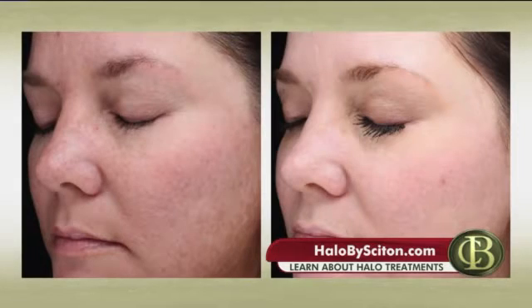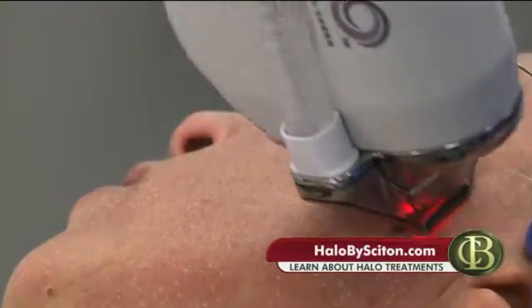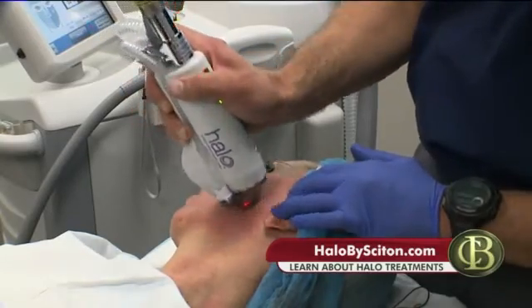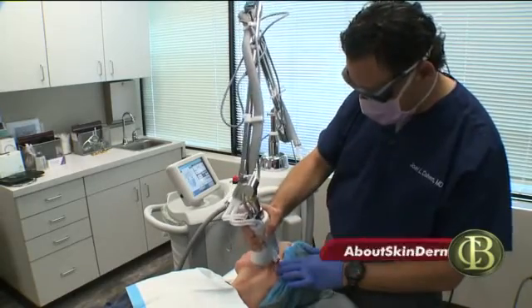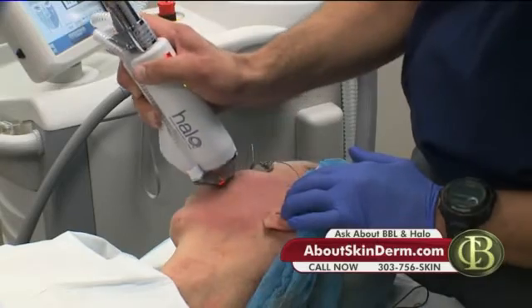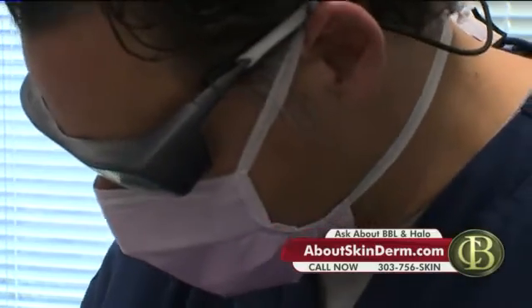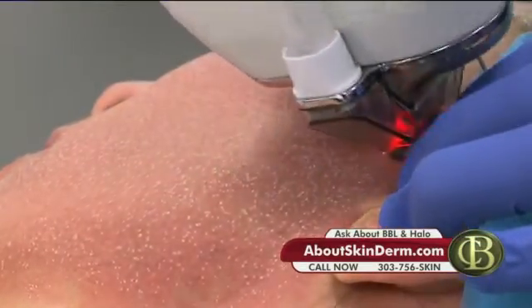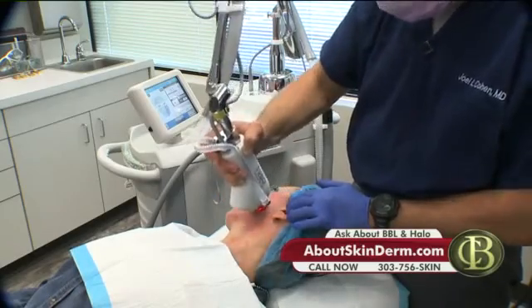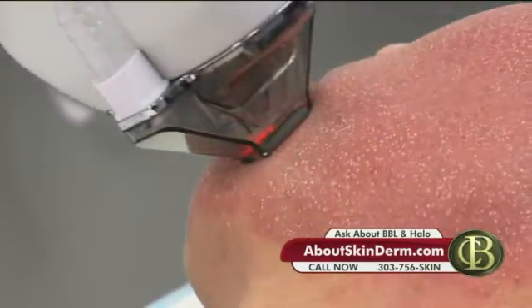This laser is more or less the double whammy of the laser world. It's a blend of 2 wavelengths. One goes deep, the other focuses on the surface of the skin, and they work together at the same time in one treatment. You were mentioning that with the downtime, it depends on how much downtime people have. You can cater it, right? You can put on more traditional settings where people may look like they're red and have a little bit of swelling or a sunburn type of response for about 5 days. And you can crank it up to more significant levels or values in these settings between the 2 different wavelengths, and people can have a bit more downtime, but you'll see more improvement perhaps in texture of specific lines and wrinkles. Is it painful at all?